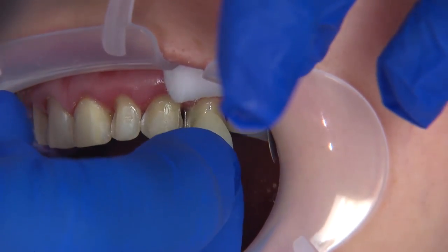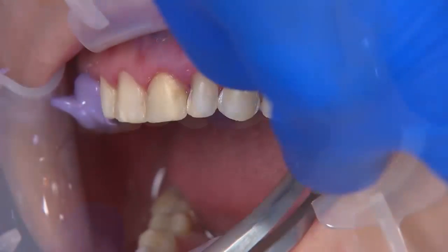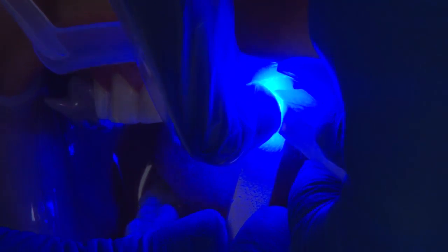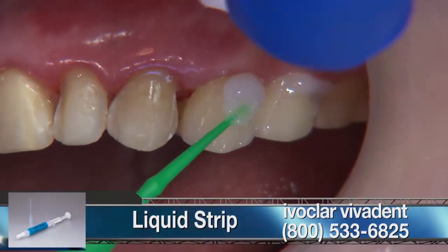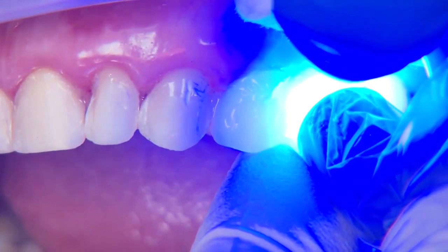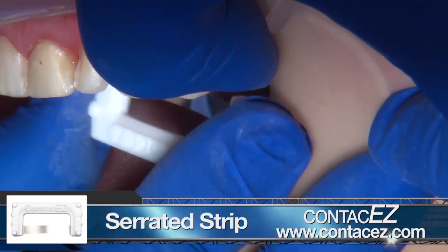In terms of isolation, cotton rolls and mylar bands were used. The veneers were placed in two sets at a time and held into place using wooden sticks, applying light pressure on the facial and incisal to ensure correct seating. For this case, it was easier to bond the veneers starting with the posteriors to get them out of the way, then going back to the two centrals and working toward the cuspids. Prior to the final cure, a small amount of glycerin — Liquid Strip from Ivoclar — was used to ensure no oxygen inhibition at the margins. Once the veneers were tacked and waved into place, the matrix was removed to allow removal of excess cement. An explorer was used to cleave off the excess and a saw to separate the cement from the interproximal area.